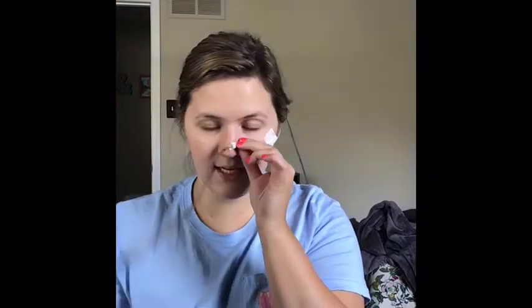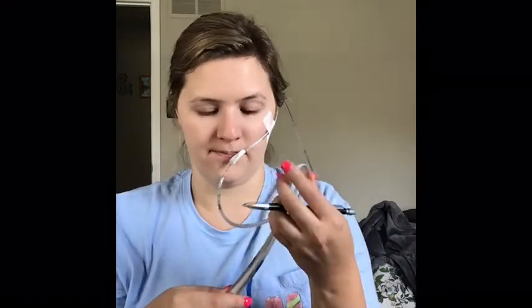So what I'm going to do, and I didn't say this earlier, but I'm going to let that just flop for a minute. I don't have a piston syringe, but you would get a 60 ml syringe and you would hook it at the bottom before you even put it in. This is so you would assess your pH. So at this time, if I had a syringe, you're going to clamp your, so my syringe would already be there.